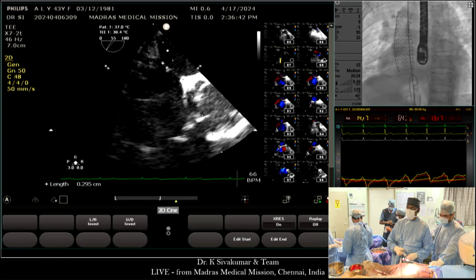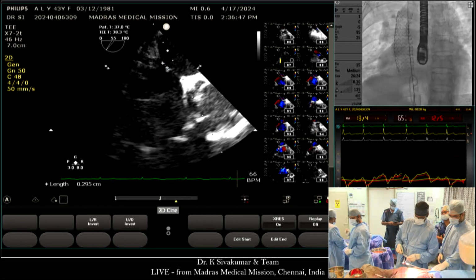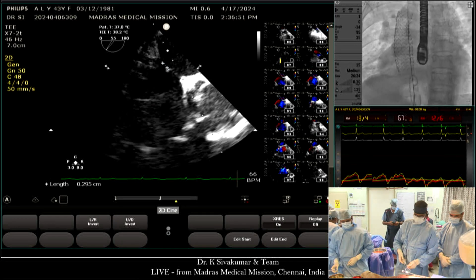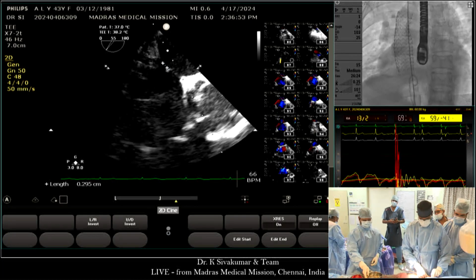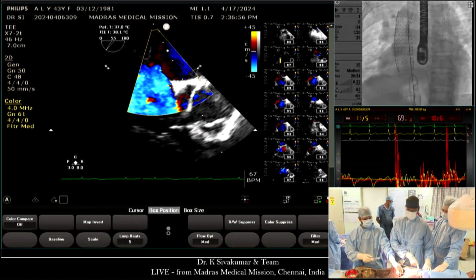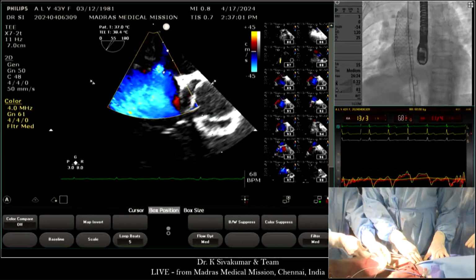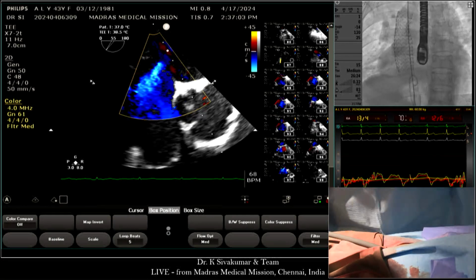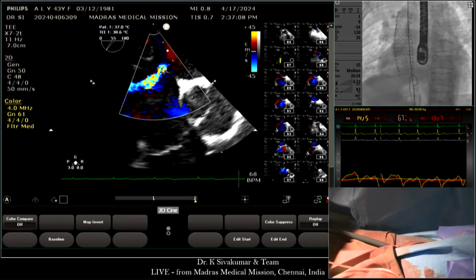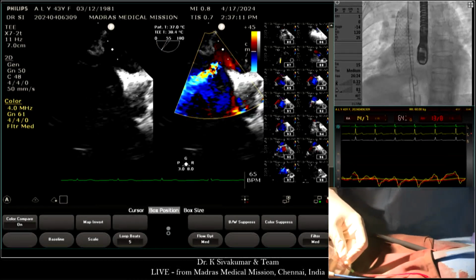I have two questions. One, at what point in time would you consider enlarging the sinus venosus? Do you do that based on CT or just hemodynamic measurement? And number two, if the surgeon tells you that they plan on doing something more extensive like a Warden, does that push you to consider this procedure more? Because we know the Warden in the long term may not have similar outcomes to a two-patch or a single-patch technique.